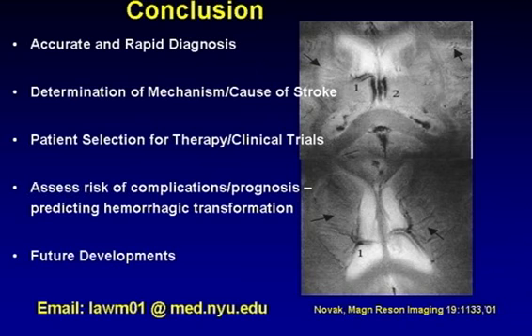Lastly, this is our 7 Tesla, which is going into CBI that actually went in over a year ago now. At 7 Tesla, you can actually image some of these very small vessels very elegantly, and potentially, if you were to image these patients with high resolution, high field imaging, you can see the vessels and even see which vessels are actually being occluded at high field.